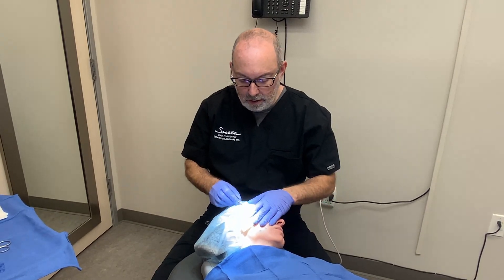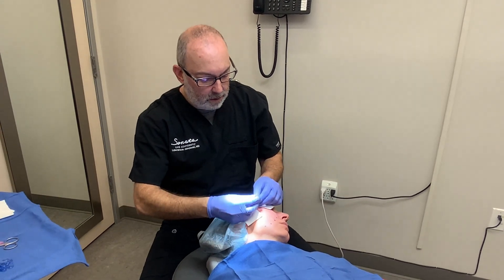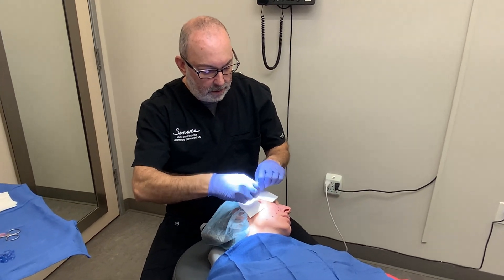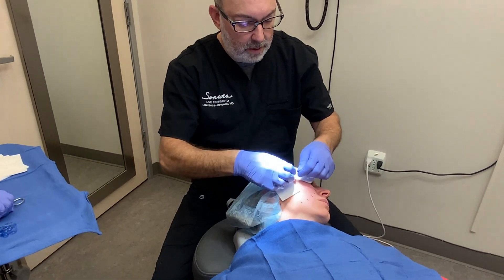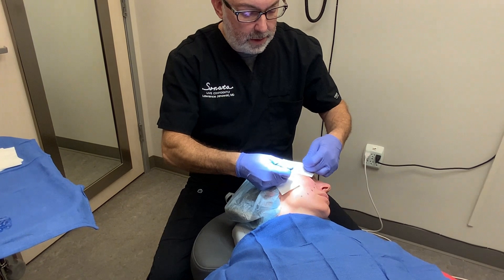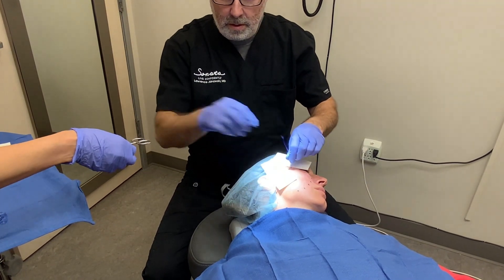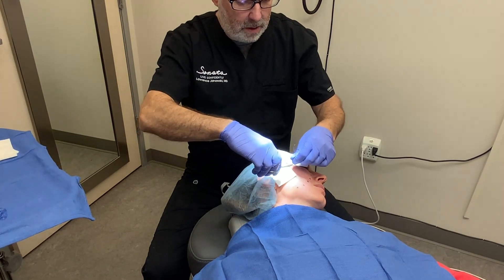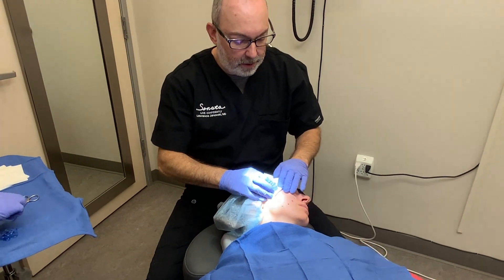There's the second one — you can feel where it is — and then we're going to tie these two together, and that gives us a nice pull as they anchor to each other. We'll cut those, and then we'll bury the knot by pushing down on it.